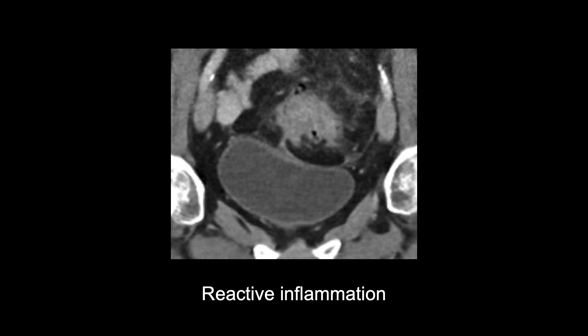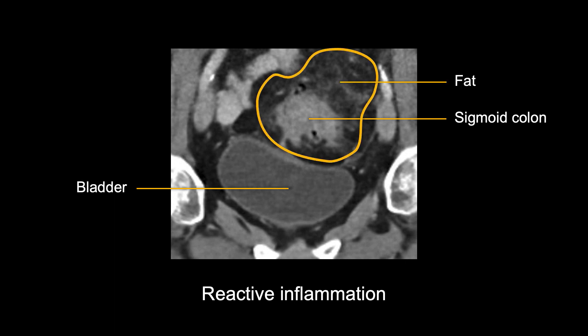In this example, the bladder is compressed and mildly thickened as a result of the inflamed sigmoid colon. Notice the hazy fat stranding around the colon in this image as well, further supporting the presence of inflammation.